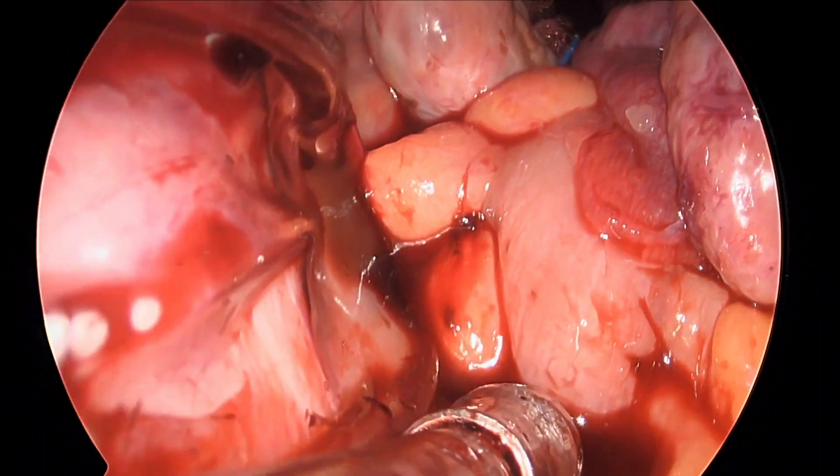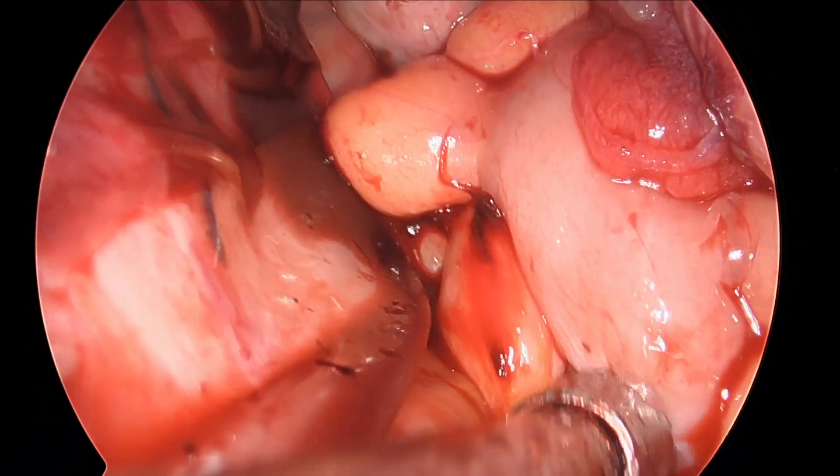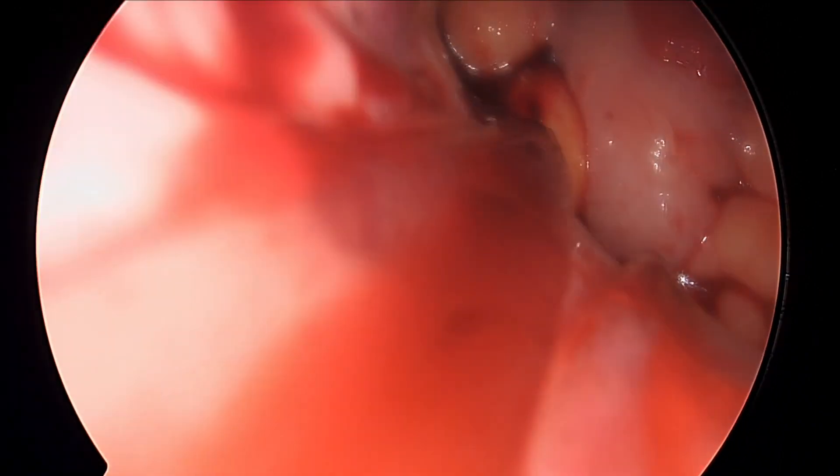Alternatively, the gel seal cap can be removed, a Yankauer suction used to suction the field, and the gel cap is placed back on to continue the case.